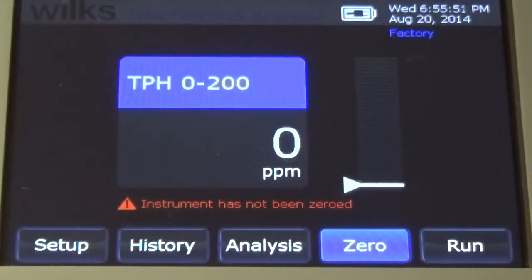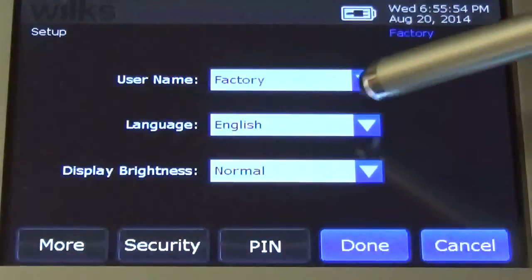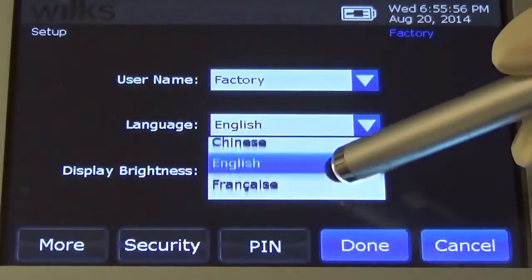To change the default language, select Setup, then scroll to the desired language and select Done.